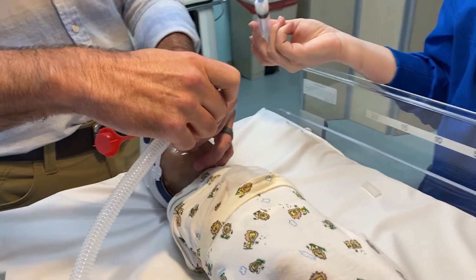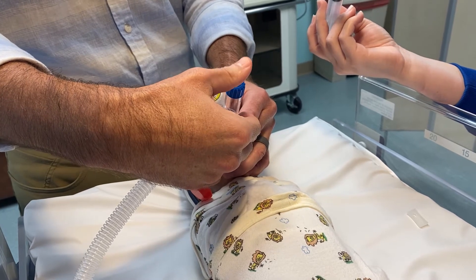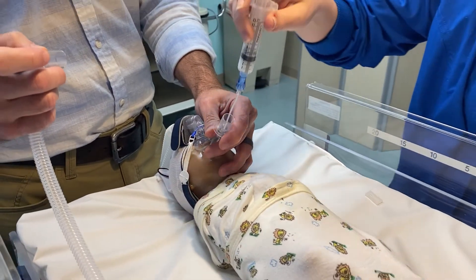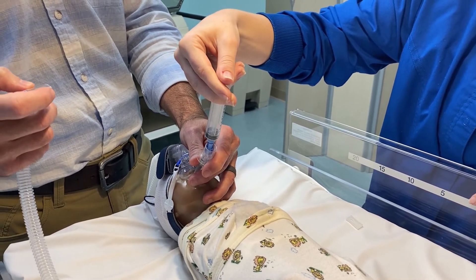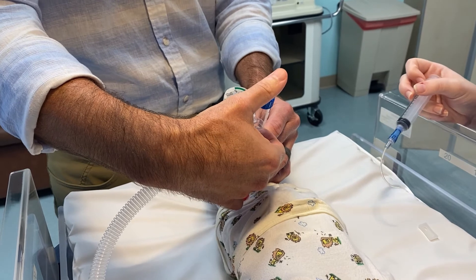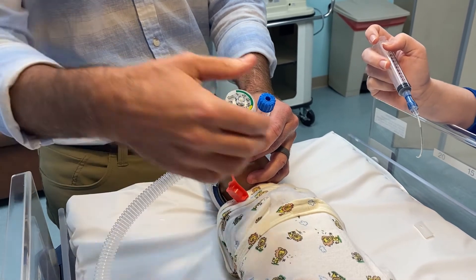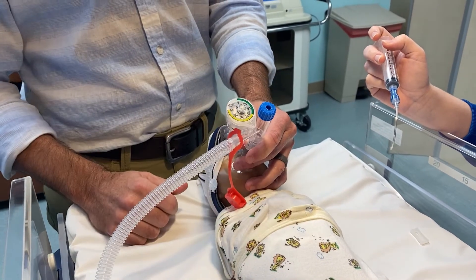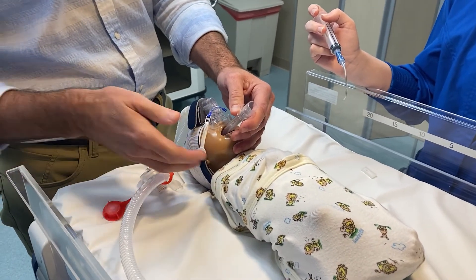Connect the device again, allowing the surfactant to go down into the lungs — give a couple of breaths if needed. Go ahead and complete the surfactant dosage. You'll give the traditional amount as if you were giving it through an endotracheal tube. Allow time for the surfactant to push down into the lungs a bit longer on the last bolus. Once you feel it's in place, check and make sure no surfactant is coming out, then pull the device.